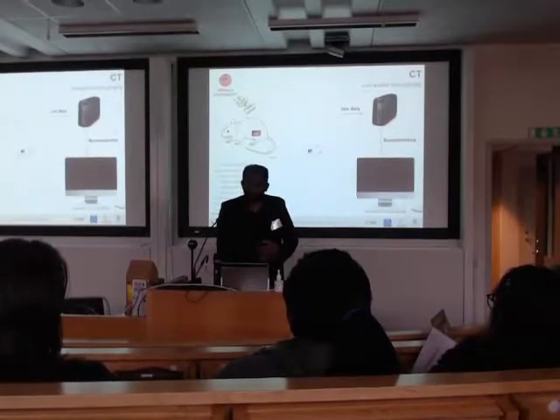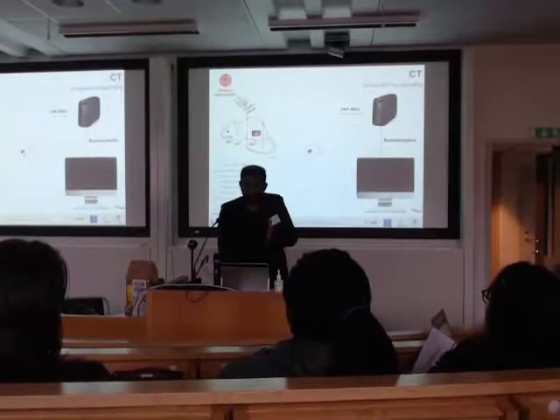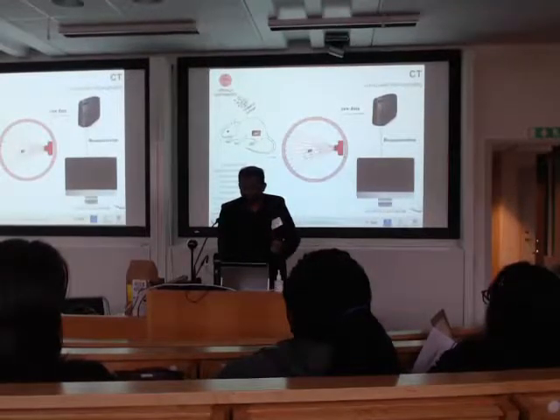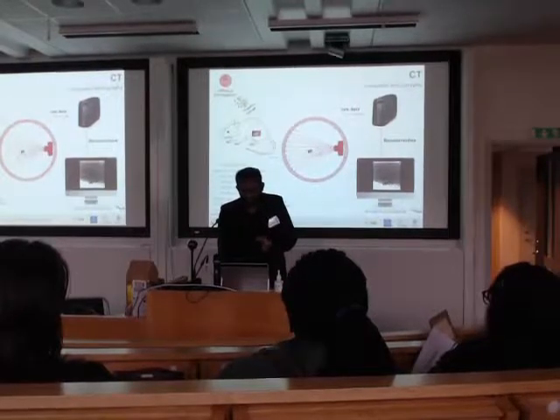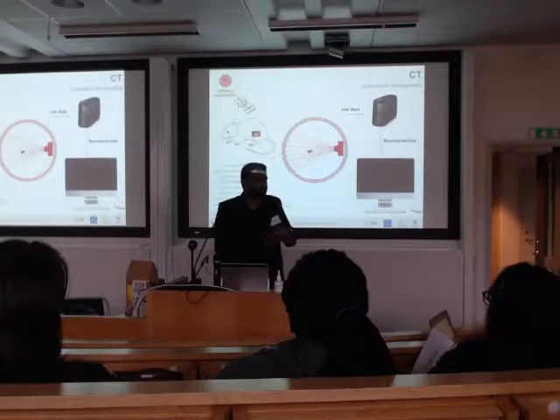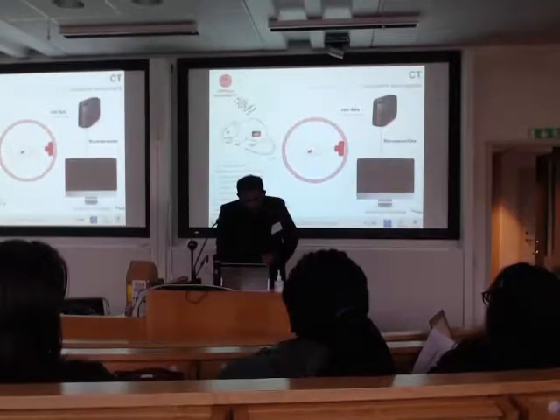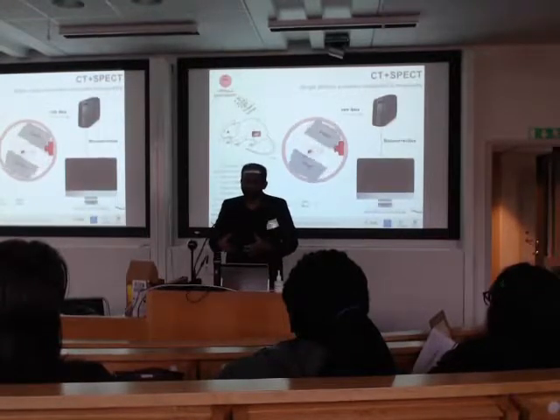To start with, we have to position the animal in the camera. So we use the SPECT. This is the site where we want to image. We start with a simple CT scan to position the animal. As you can see, the clamp that holds the fracture together. This procedure takes around 5 minutes. And then at the same position, we perform a SPECT scan. It's a 2-head SPECT scan, and we perform the SPECT analysis for 30 minutes.